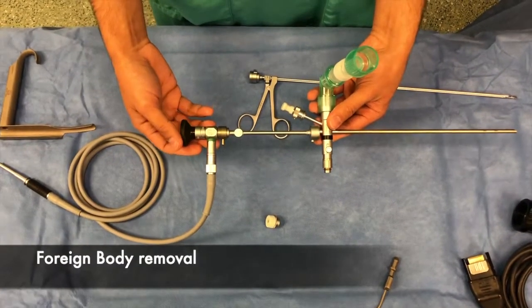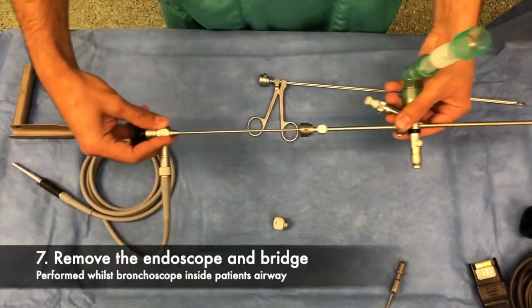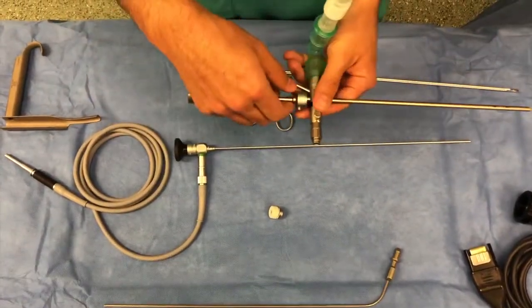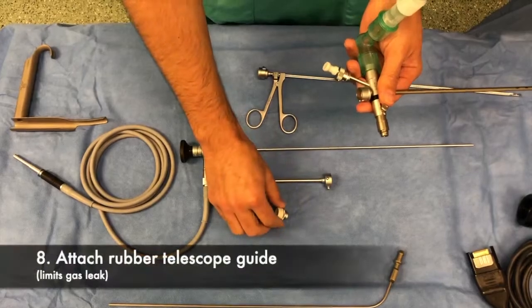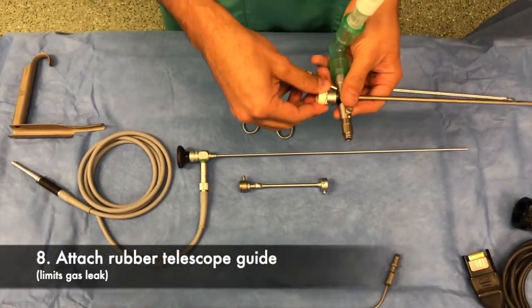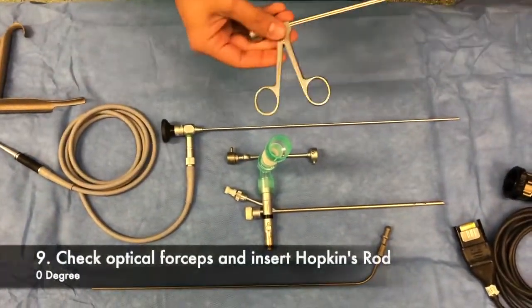If a foreign body removal is being performed, the next step is to disassemble parts of the scope. The Hopkins rod is removed, followed by the bridge. The patient can continue to be ventilated via the rigid bronchoscope, and to prevent air leak, a rubber bung or guide may be placed over the end. Instruments can also be passed through this.